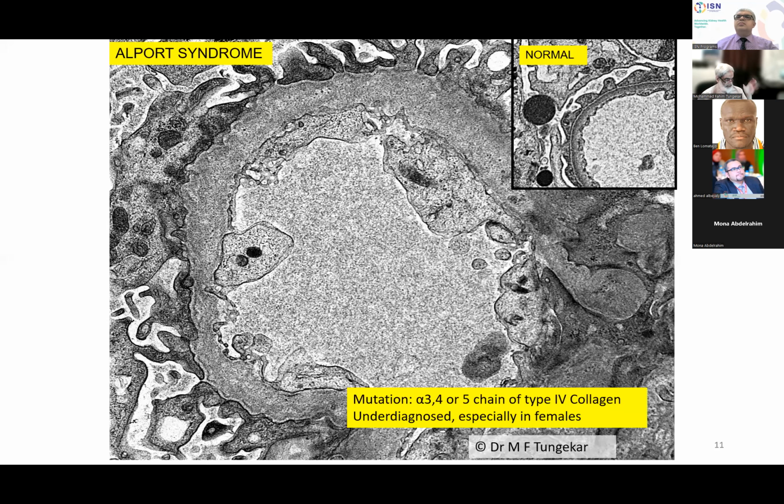Whereas glomerulopathy will confine itself to glomerular conditions like presence of fibrinoid change, KWS, and thickening of the basement membrane and capsular drop. Most of them can be recognized by light microscopy, except for the early GBM thickness, where only electron microscopy helps.